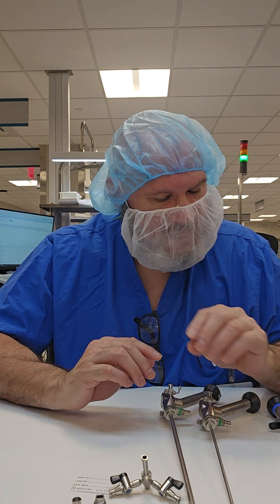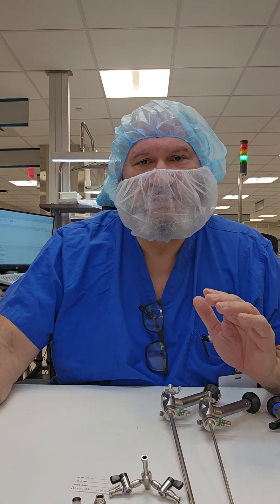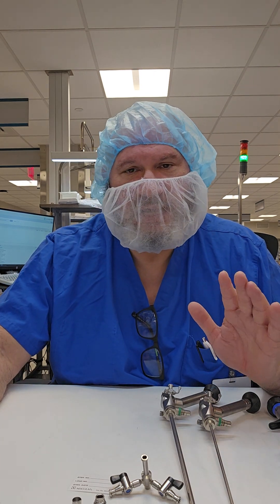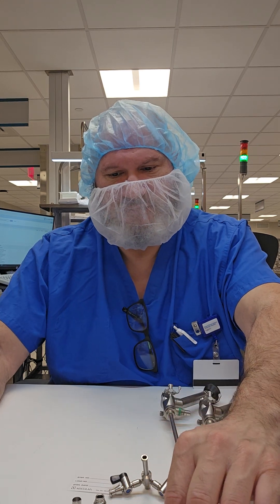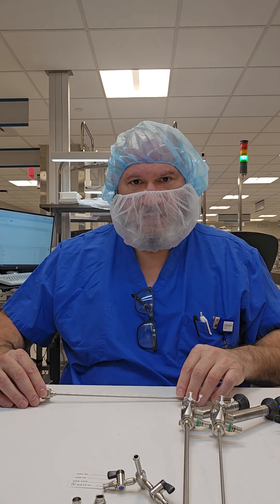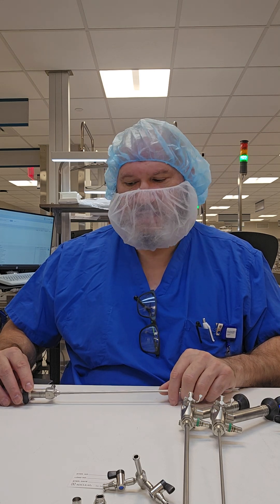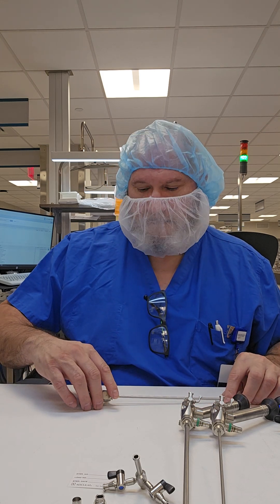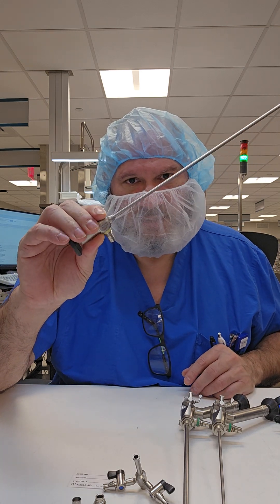Rigid and semi-rigid scopes — we want to make sure that we handle them carefully. Do not ever grab a scope by the shaft. This is the shaft of the instrument. You never want to pick it up by the shaft; you always want to pick it up by the eyepiece and light post body.